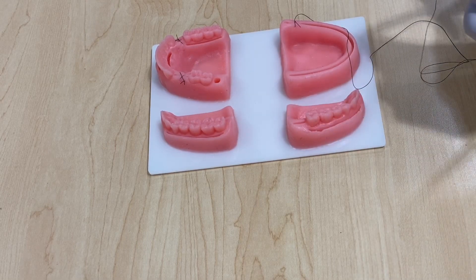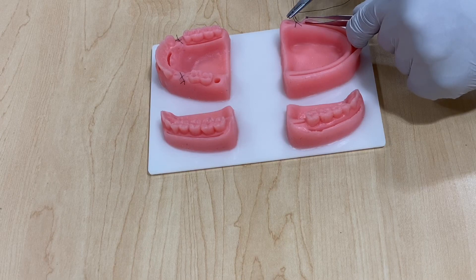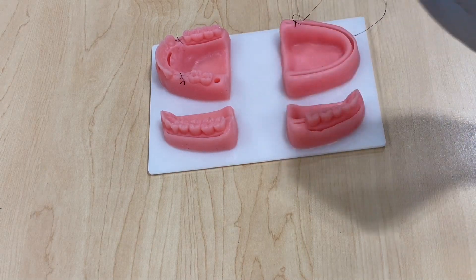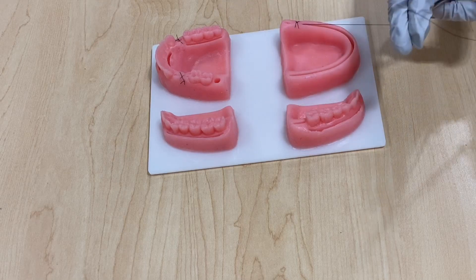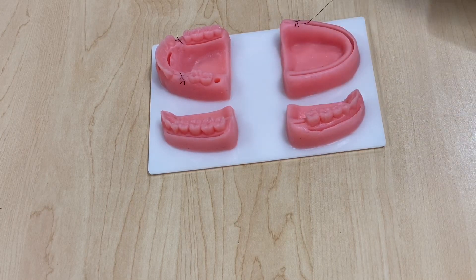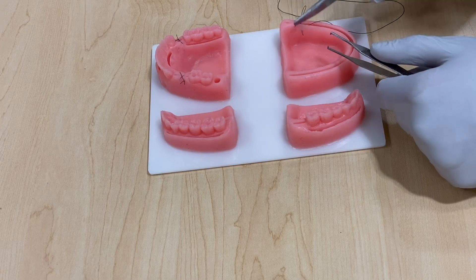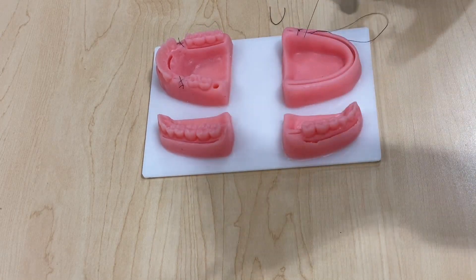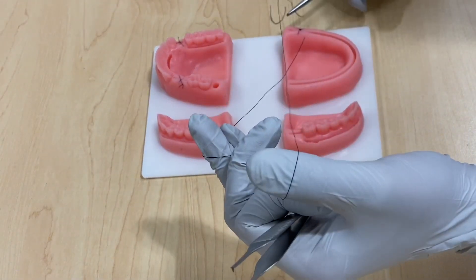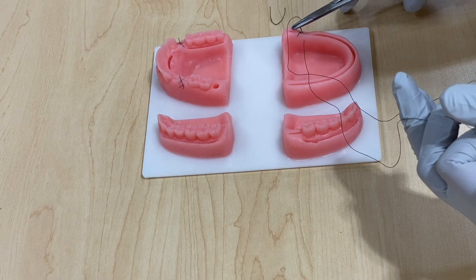Now you want to run the suture through the flap. Start on the buccal — I like to go on an angle, I think it looks nicer. Get your bite. Then at equal distance, go on the lingual or palatal — make it symmetrical. If you entered here, you want to go exactly the same on the lingual or palatal. Then go equal distance on the buccal — keep it nice and symmetrical.